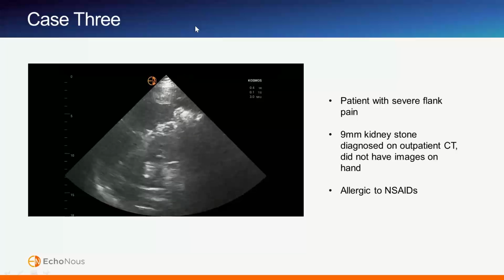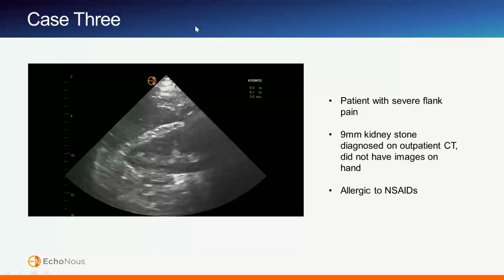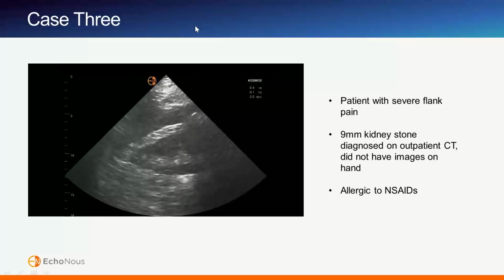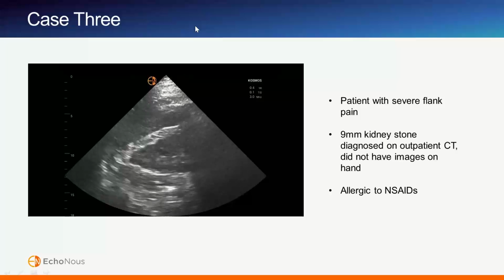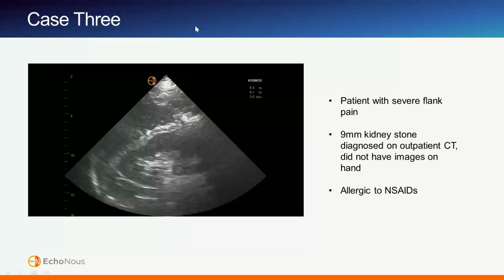So I like the idea of a gray area cutoff where, at 2 millimeters, I feel comfortable with you not having urology follow-up, just talking about the stone size. Yeah, I totally agree. The real beauty of point of care ultrasound in the emergency department is that you don't forget you have your patient there in front of you as well. For me, if a stone's 4 millimeters and I see some hydro confirming that there's a stone, and the patient's keeled over in pain and I'm not able to control that, that probably gets either an observation or admission stay for intractable pain, plus or minus a urology consult in the emergency department.